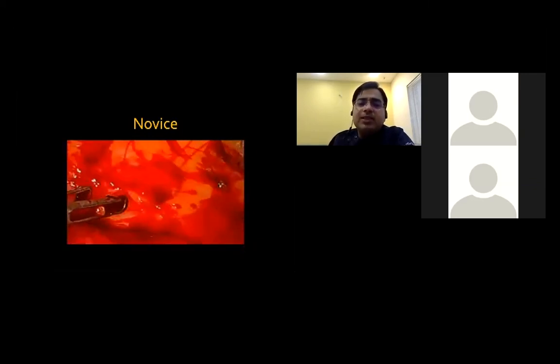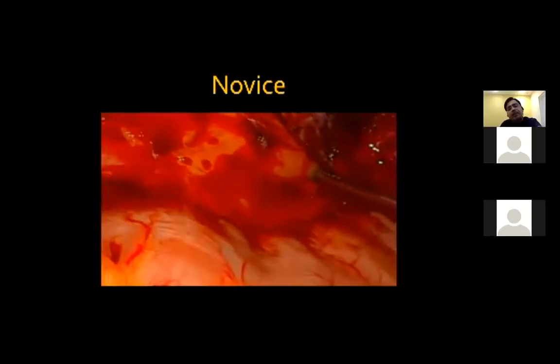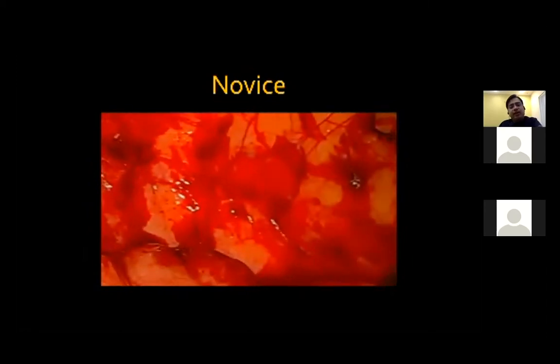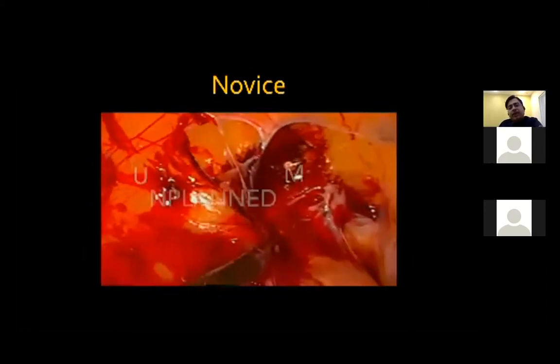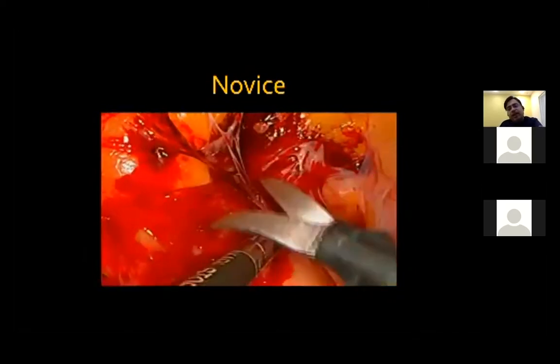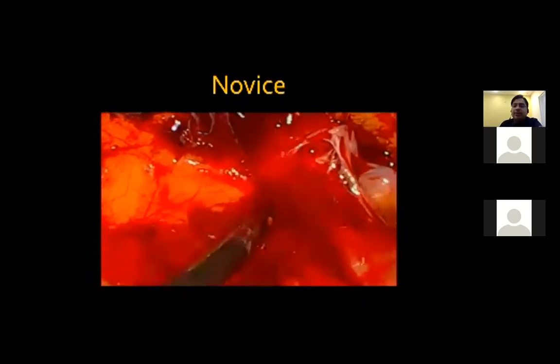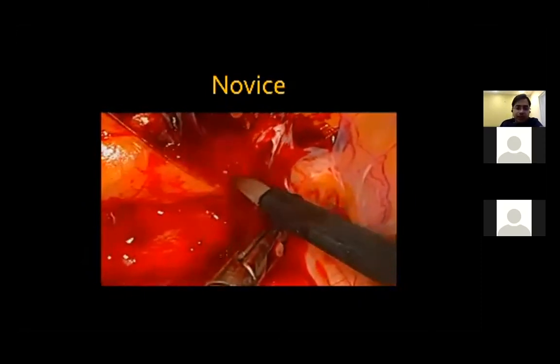So there is an immense role of reviewing what you do. See, the left hand in this particular situation was just not moving. So if I were this novice surgeon, I would tell myself that I did not use my left hand adequately, so I should practice exercises with my left hand. The traction and counter traction was inadequate, so I should lay emphasis on that. My movements were unplanned. That means the basic executional steps of surgery were not printed in my mind. So this will be my take home message from this particular video. And that is what I advise everybody.